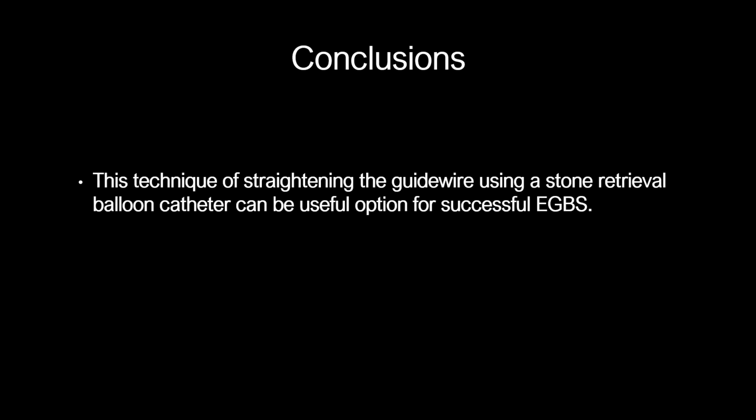In conclusion, this technique of straightening the guide wire using a stone retrieval balloon catheter can be a useful option for successful endoscopic transpapillary gallbladder stenting.